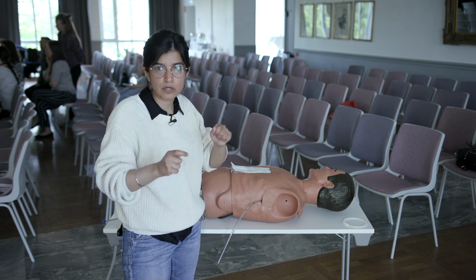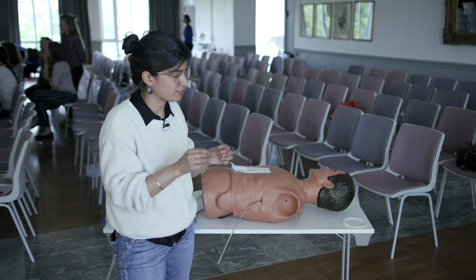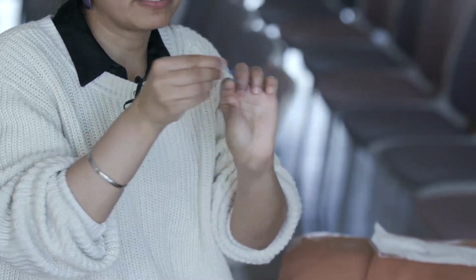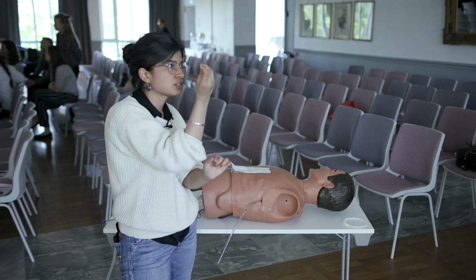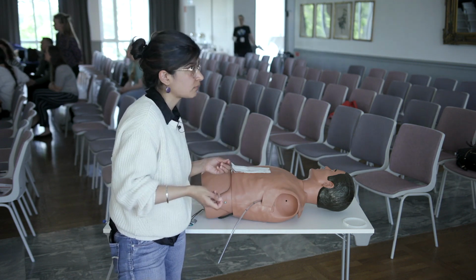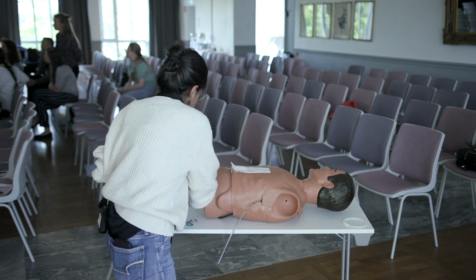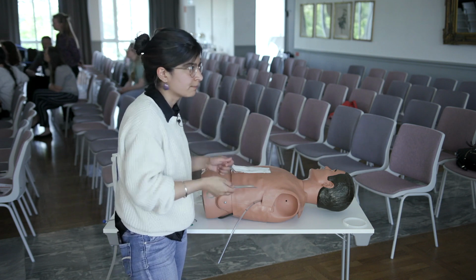So tie an air knot, and if you don't know how to tie that, we can go over it very quickly, but I may not have enough time. But essentially, you've gone through the skin, you've come out, now you're tying, but if this is your skin, you want to tie on my finger. So there's a gap of this much between your knot and the skin. Do you use anything to put in between? Yeah, exactly. You can. I do this frequently enough that I have a feel for it. But if you don't, take your Kelly, stick it in there, and tie on the Kelly. When you take it out, there'll be a nice little loop there.